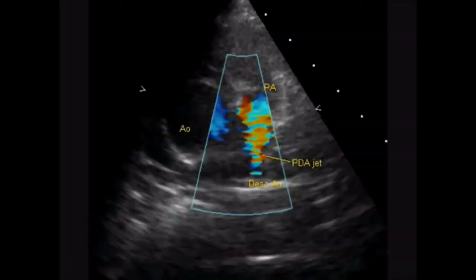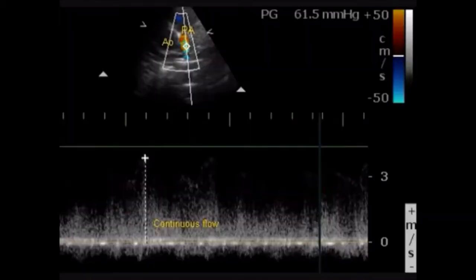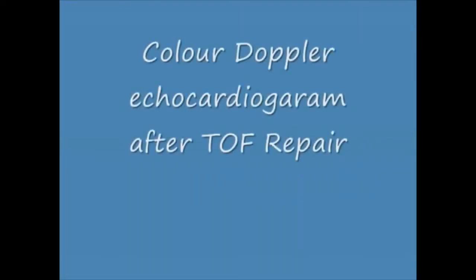This is the patent ductus arteriosus in a case of Tetralogy of Fallot. You can see the flow into the pulmonary artery, which is a continuous flow. This is the CW Doppler — continuous wave Doppler — of the PDA jet.